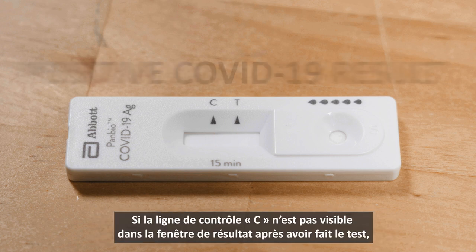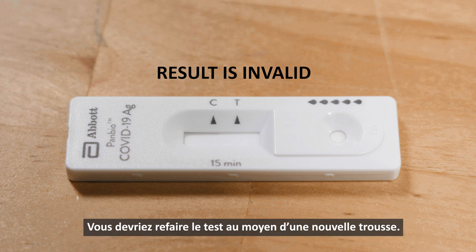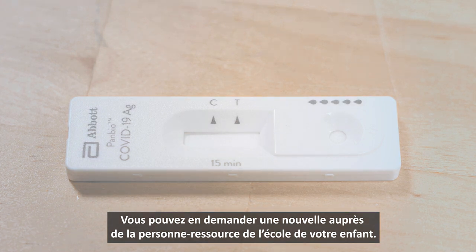If the control line marked C is not visible within the result window after performing the test, the result is considered invalid. You should retake your test using a new kit. A new kit can be requested from your contact at your child's school.